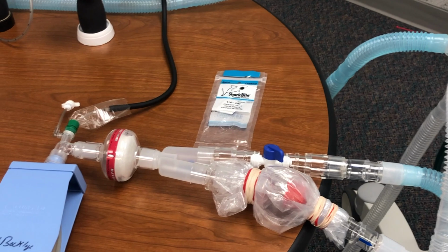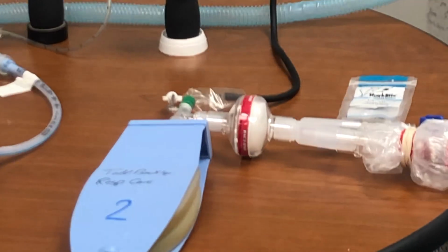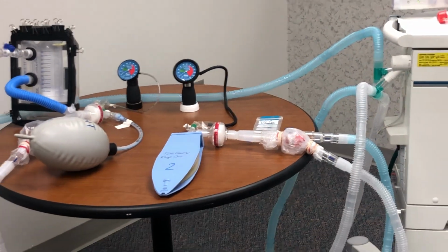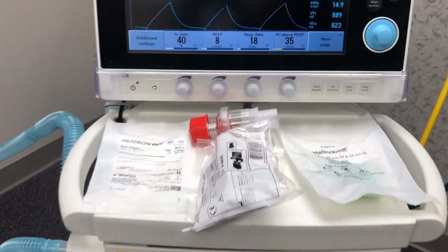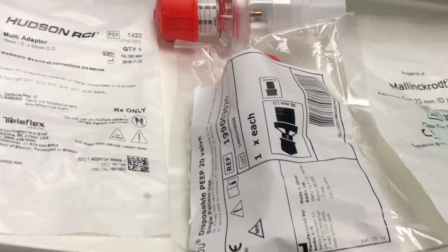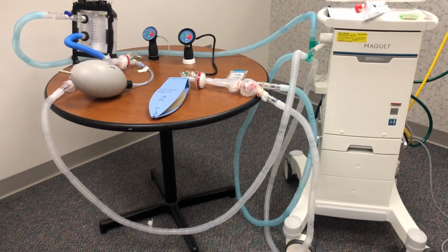This is a 1/4 inch valve which is connected to the Y piece, and this is connected to an HME filter which also acts as a humidifier. So you don't need humidifier in this setup. And here we are ventilating one lung, and on the expiratory circuit here I have attached a PEEP valve. The reason for the PEEP valve, basically this is a PEEP valve available in the hospital, and it usually goes on an Ambu bag, but you can use any PEEP valve here. And this is the picture of the PEEP valve. This would actually control individual PEEP in this setting. So this completes the circuit.